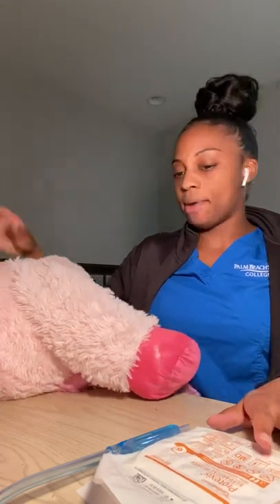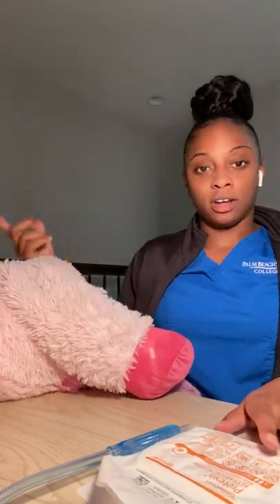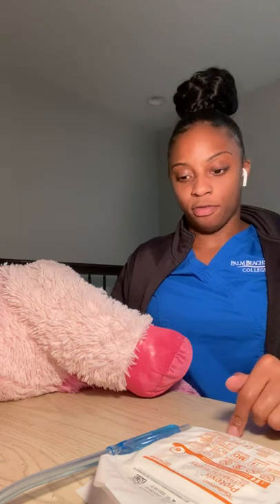I'm going to be doing my assisting with amniotomy skill. I have my patient here. The doctor's at the bedside with me. He's going to be performing the actual physical amniotomy, and I'm just going to be here as an assistant to him.